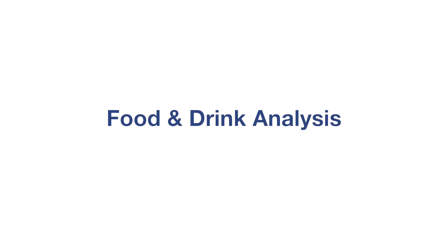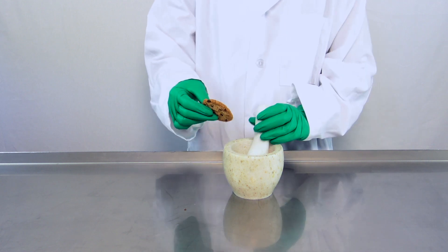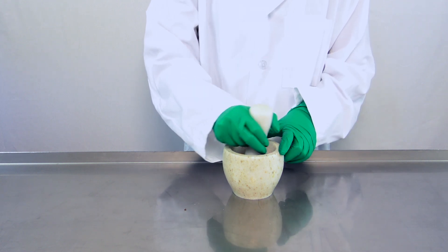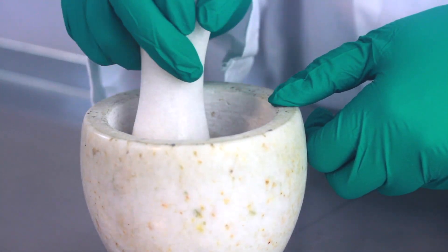Let's get started! Food and Drink Analysis. For solid food samples, use a clean mortar or mincer to break down the sample. Grind to fine crumbs. If your sample is a liquid or doughy texture, refer to the manual.